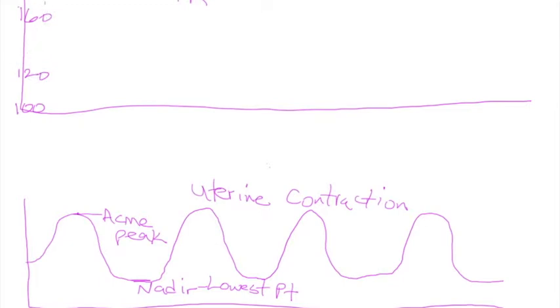When you look at variability, you want to see a fetal heart rate that has some variability, fluctuations.